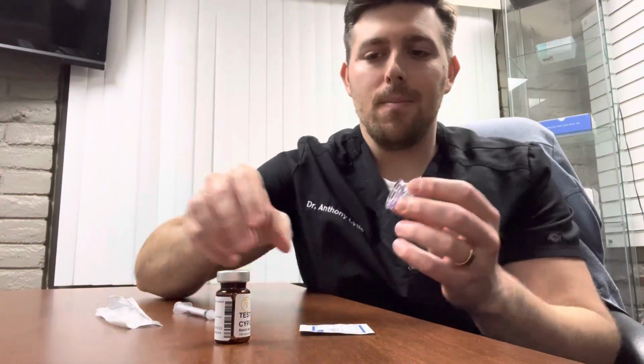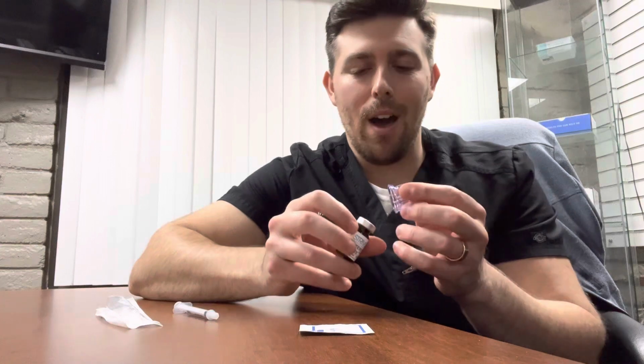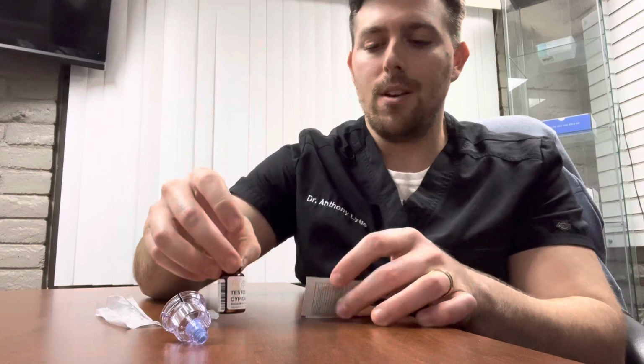I want to make a video about how to use a Swan Lock, what I call a topper, that goes on top of the testosterone vial. I want to be able to use this in case patients have any questions. So I want to demonstrate for you to show you how it works. I have my testosterone vial here.